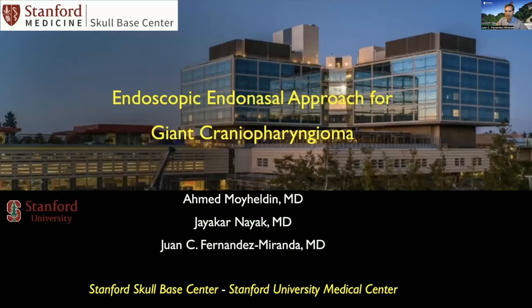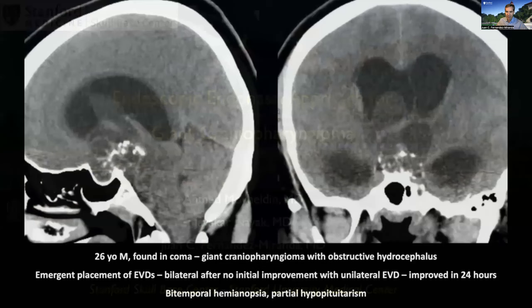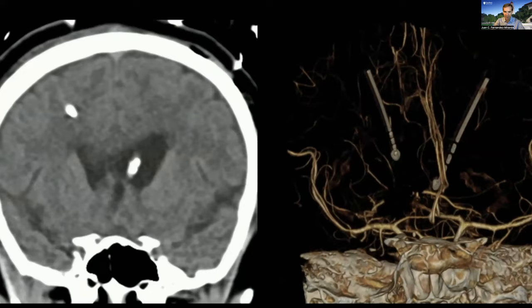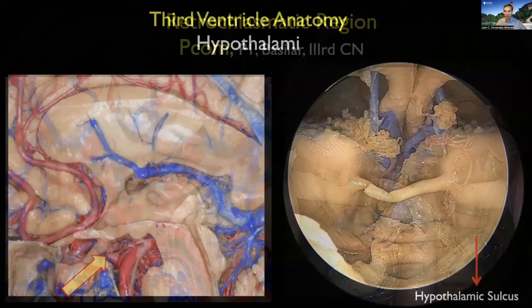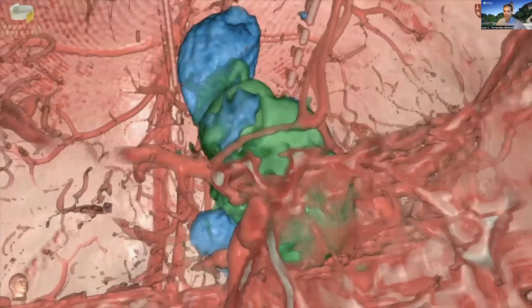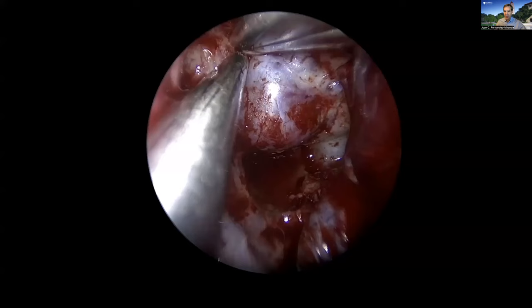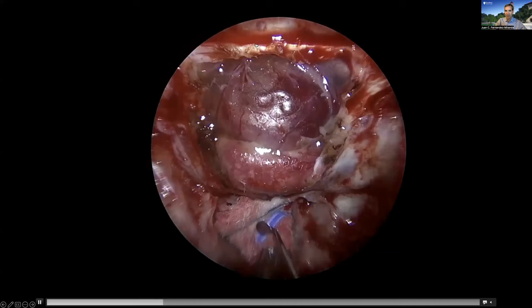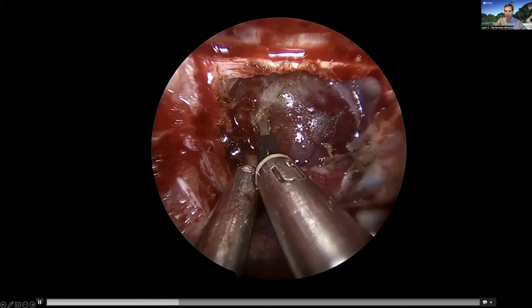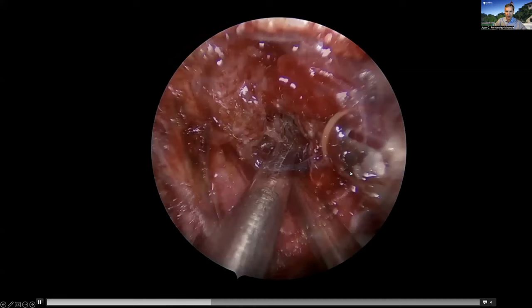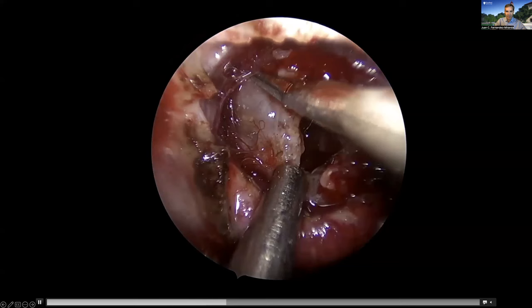Some of these tumors can become extremely challenging, like this one — a really large craniopharyngioma. The patient presented with decreased level of consciousness, obstructive hydrocephalus treated with external ventricular drains, both ventricles were trapped, and this very large tumor was approached entirely endonasally. By working within the tumor and knowing how to expose and bring the cyst walls down, you can remove all of this endonasally. The exposure is similar: the sella is expanded, with the limbus of the sphenoid as my dural opening landmark. I identify branches going to the tumor capsule so I can preserve the main stem of the superior hypophysial artery, find the pituitary stalk, debulk the tumor, and preserve the superior hypophysial artery branches throughout the cisternal stage.